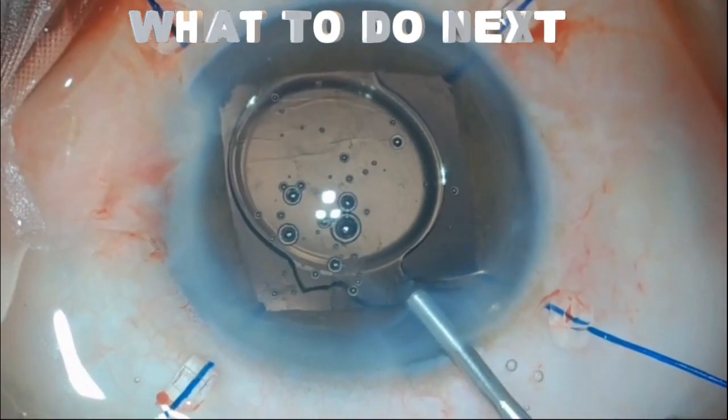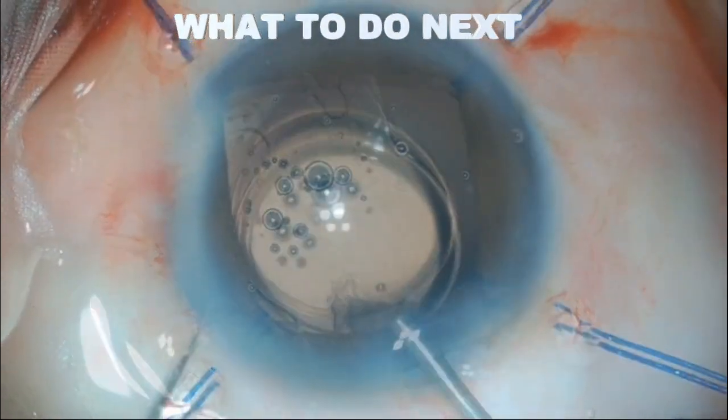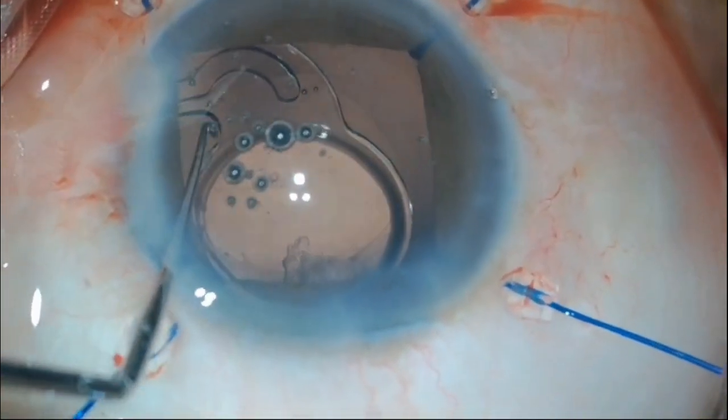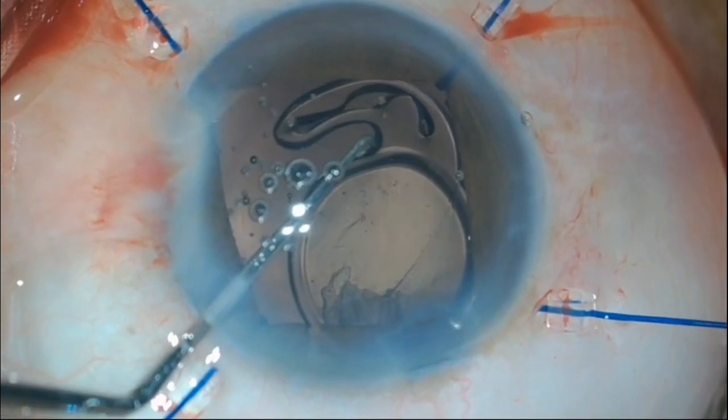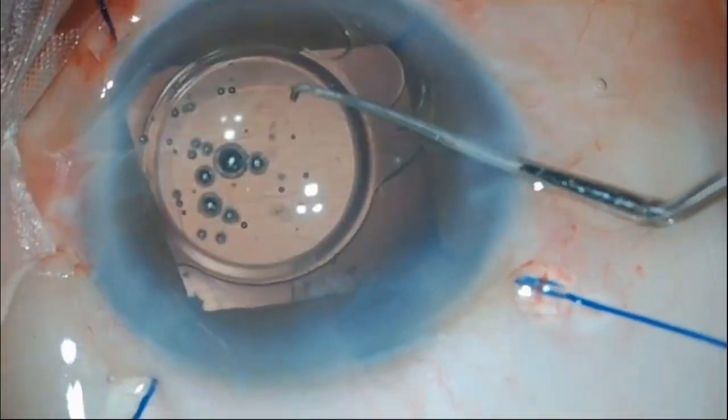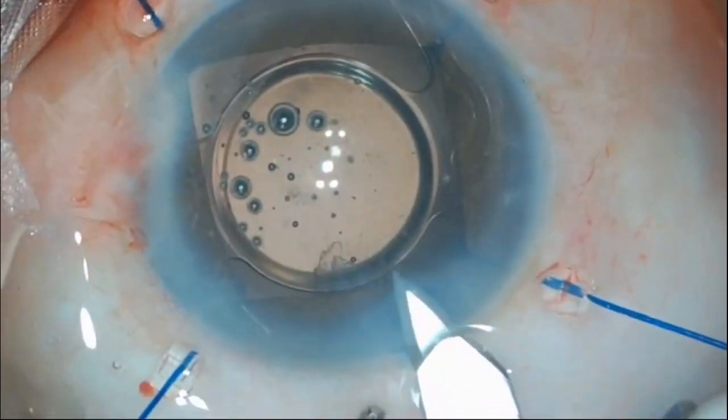This is a final case scenario where the haptic was broken while injecting. Now what to do next? Our first priority is to protect the endothelium. The second priority is to safely remove the IOL without damaging the bag.